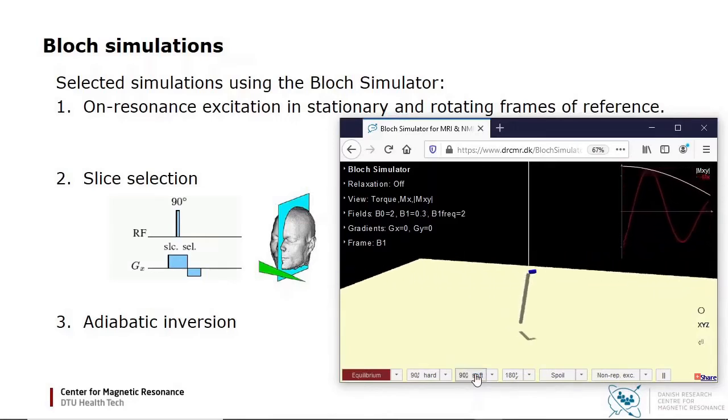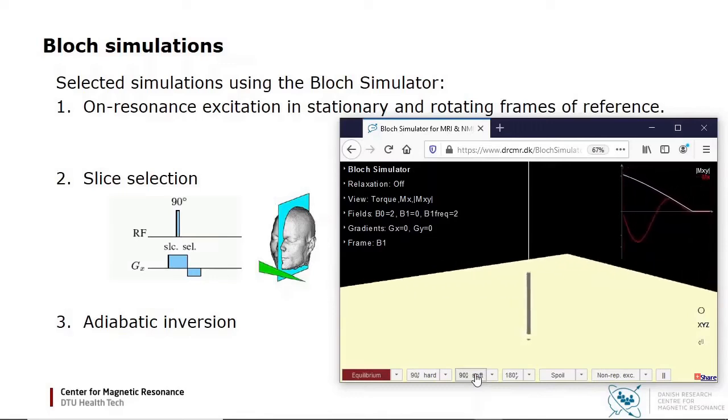In general, the RF field is not applied on resonance. During slice selection, for example, a field gradient is applied, so some nuclei will be on resonance while others will not. I will introduce a spatial distribution of nuclei and a field gradient, as shown for the human head.